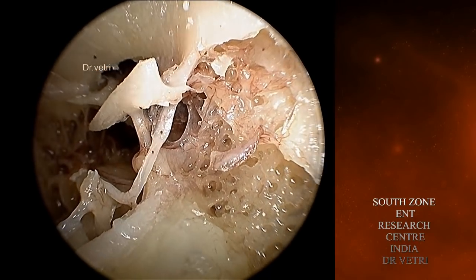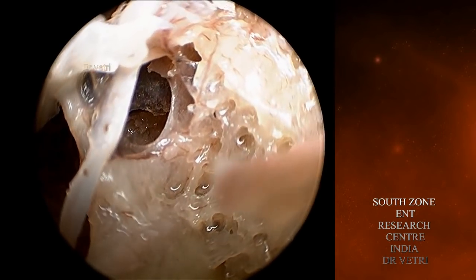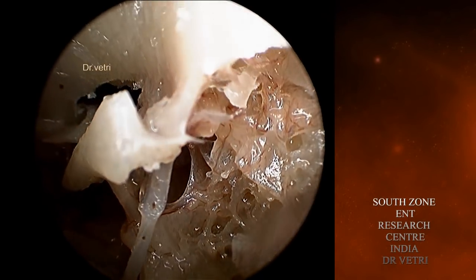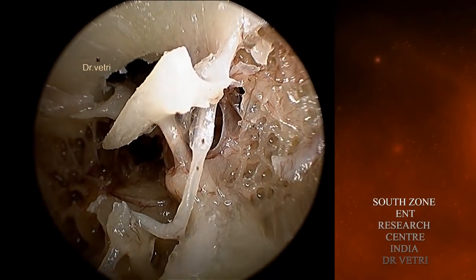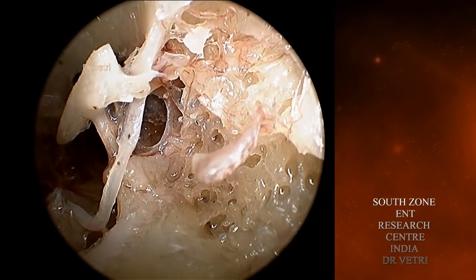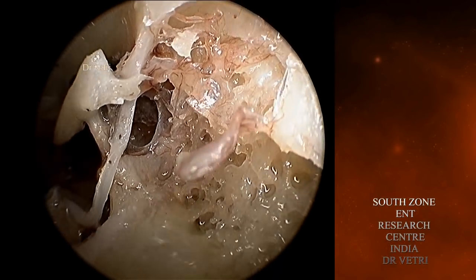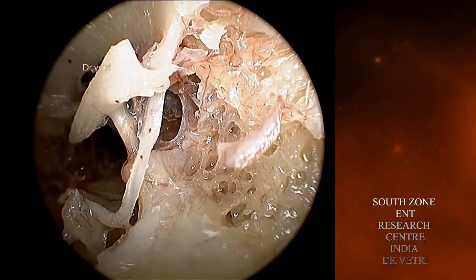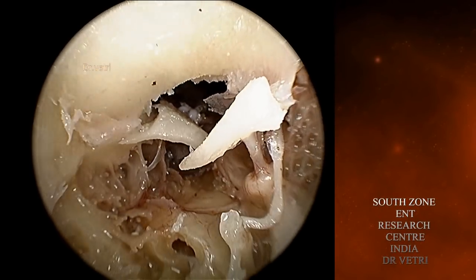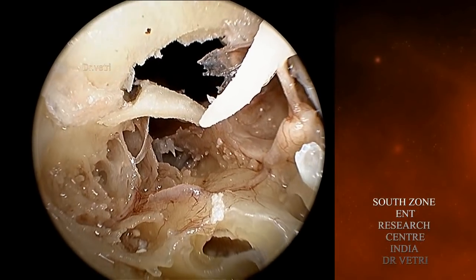This is the beautiful endoscopic view of the anterior epitympanic space. You are seeing the epitympanic diaphragm which separates the anterior mesotympanum from the attic. These are the mucosal folds which are present, though destroyed since it is a cadaver. That is the tensor tympani tendon. You can see the anterior canal wall is broken.